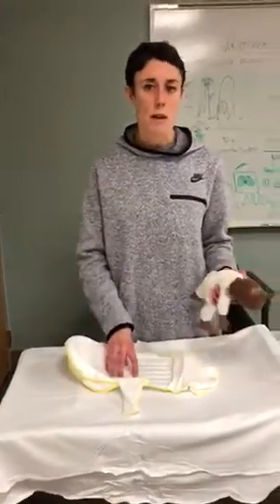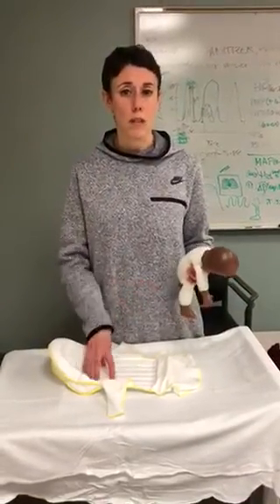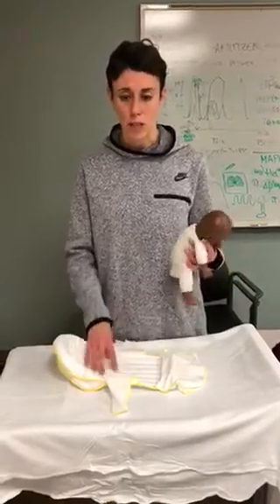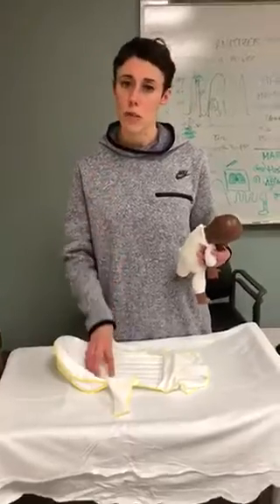We're going to be using this physician-specific — we're not going to be using these with all kids under billy lights. This is obviously for the kids that are more stable, because again you're not going to be getting a hundred percent light through these blankets.